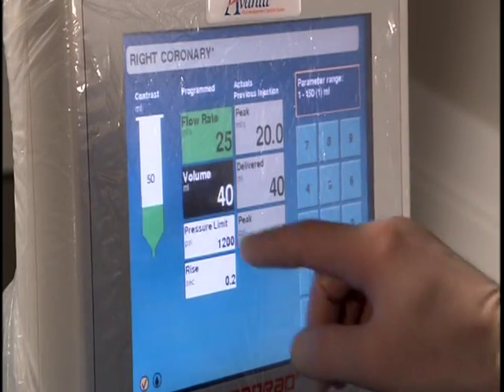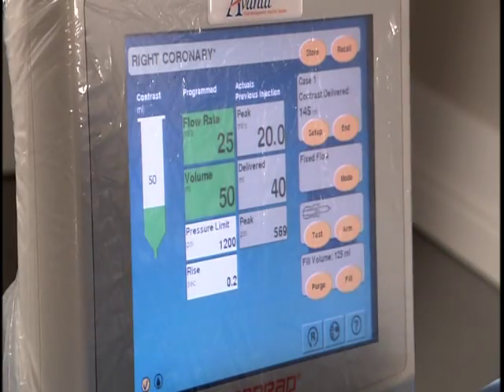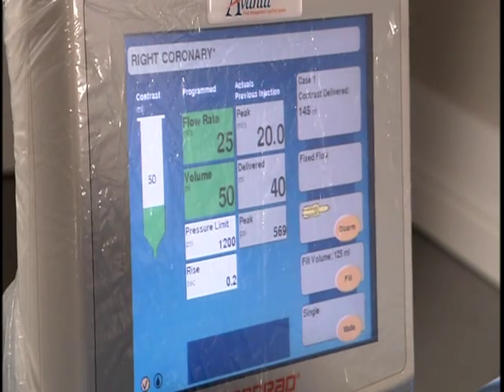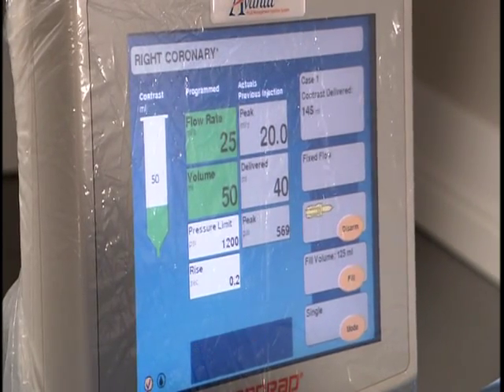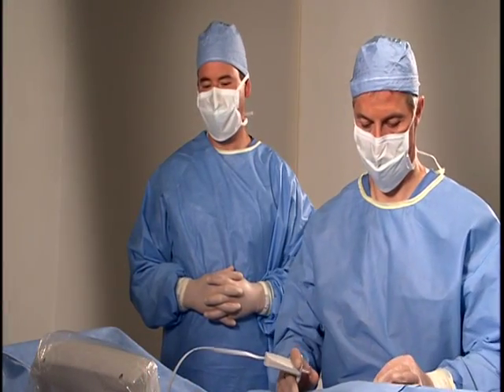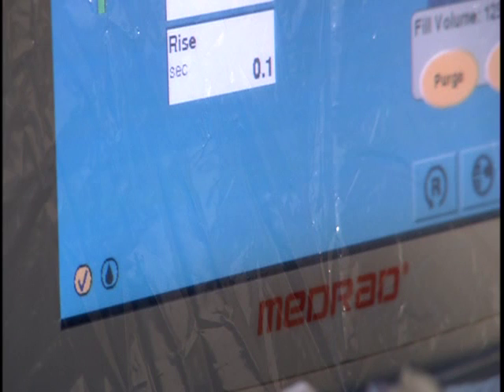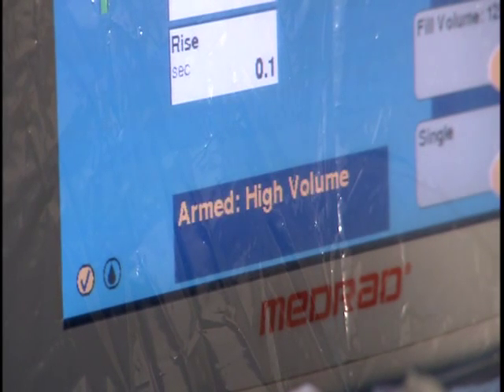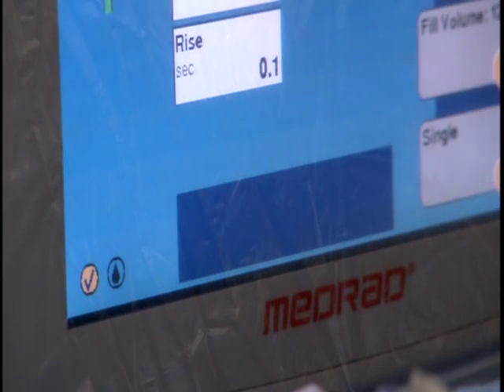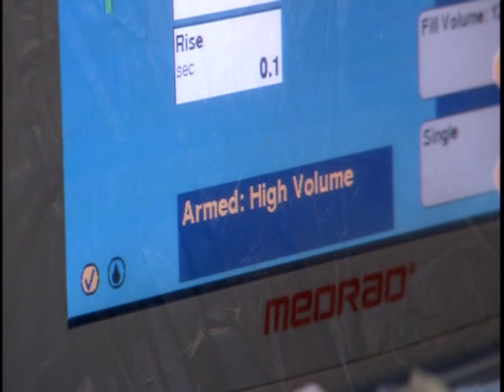A high flow rate occurs when the flow rate is greater than 10 milliliters per second in fixed flow mode only. The system beeps 5 times and the message Armed High Rate appears at the bottom of the screen. A high volume alert occurs when the volume is 20 milliliters or greater in either flow mode. The system beeps 5 times and the message Armed High Volume appears at the bottom of the screen.